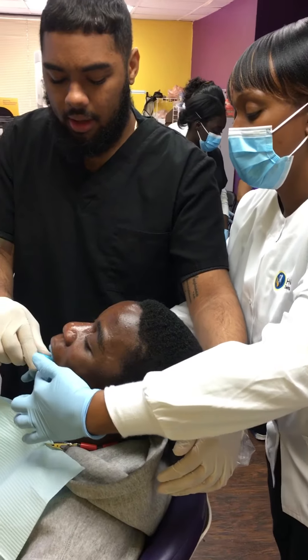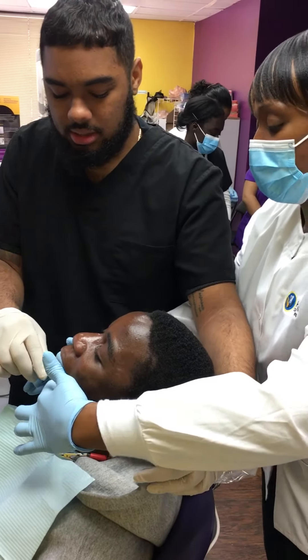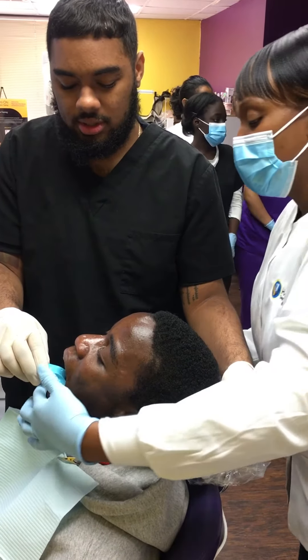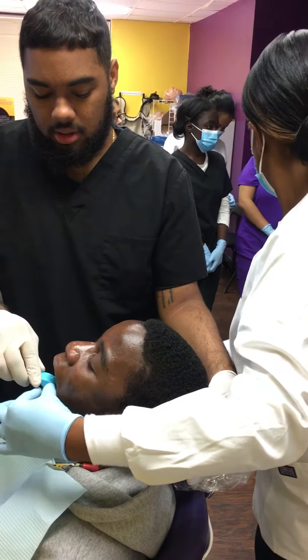Measuring cups — sometimes they're just like this behind the patient. It makes things work because then you still have to add water or add powder or something like that. Sometimes, honestly, it's better if you just run straight out of it.